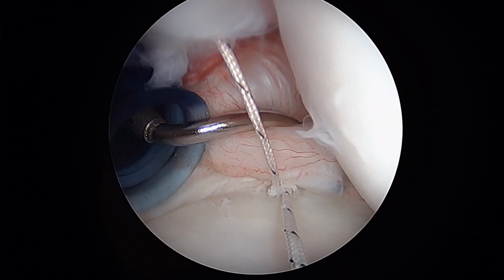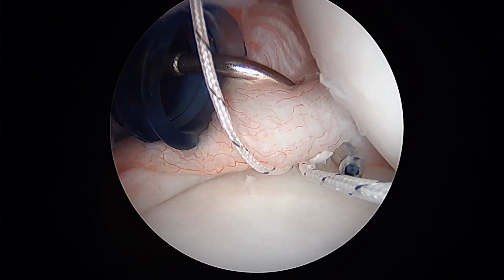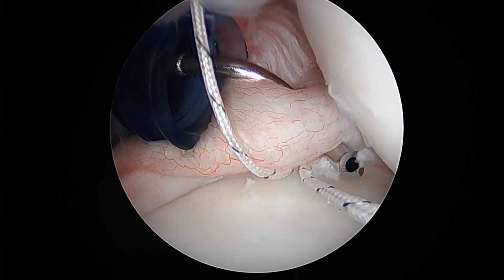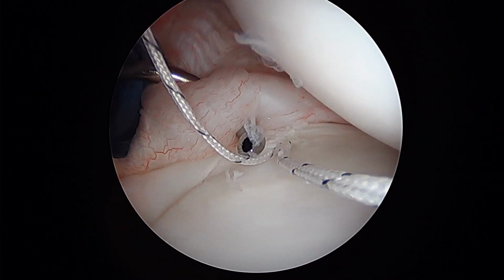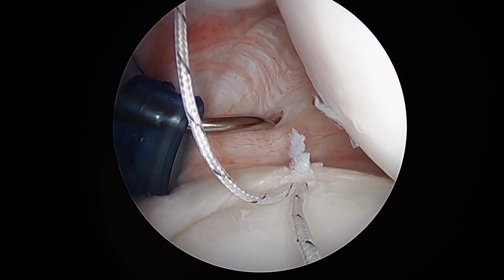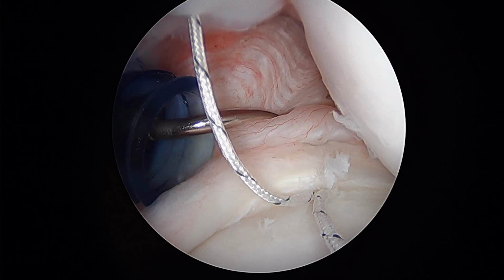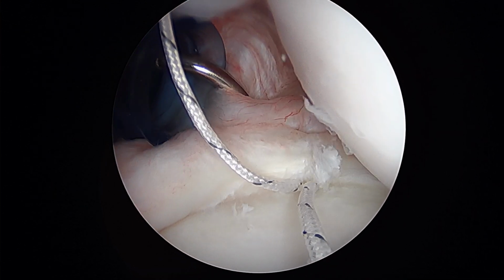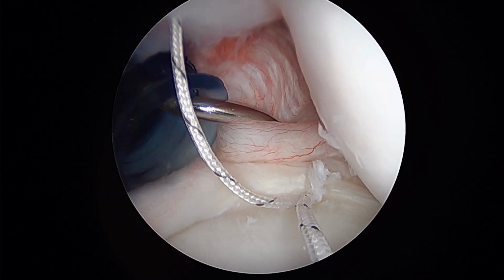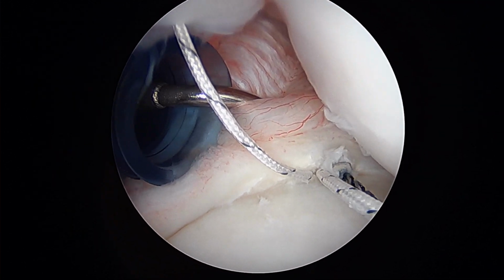We'll get this stitch done and show you some more in just a minute. Okay, here's that first stitch. This is what we call the pinch. See, this allows me to pull on the capsule. See how I do that? And then we're going to go through right there. That looks like a good bite.